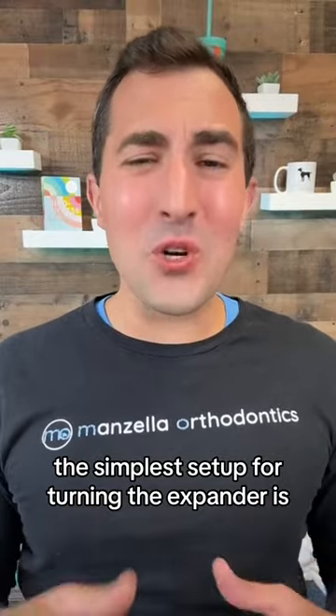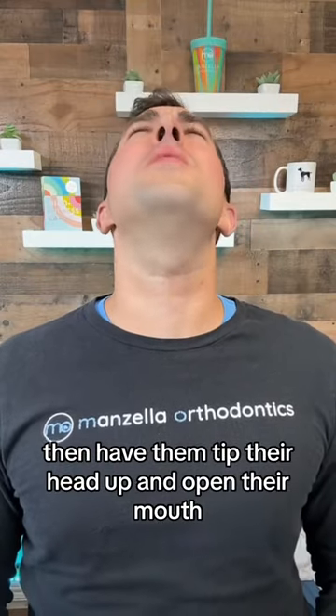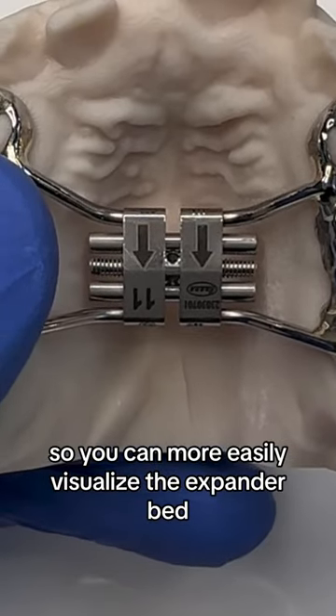The simplest setup for turning the expander is to have your child lay on a couch next to an end table that has a light on it. Then have them tip their head up and open their mouth so you can more easily visualize the expander.